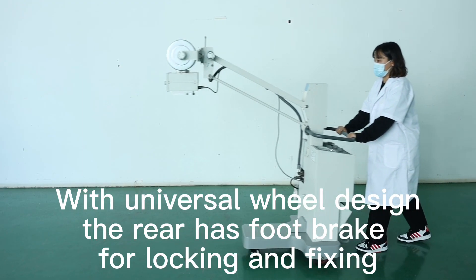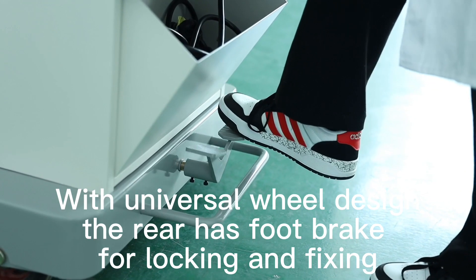With universal wheel design, the rear has a foot brake for locking and fixing.